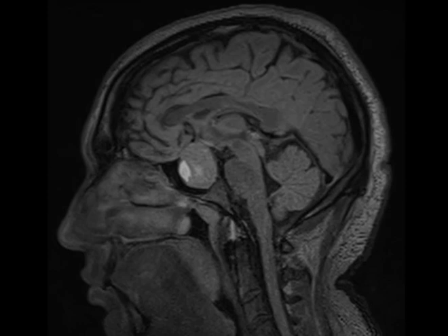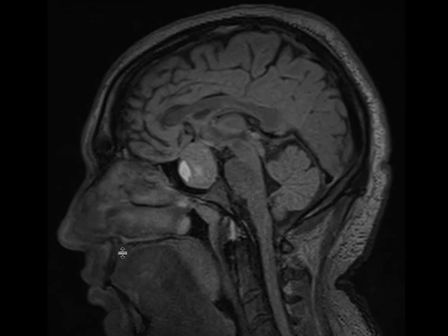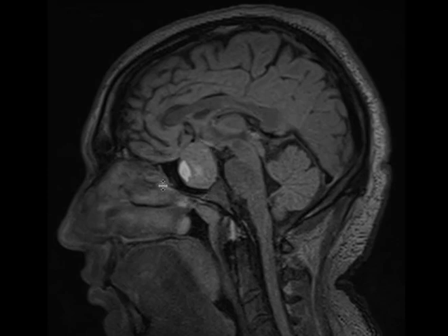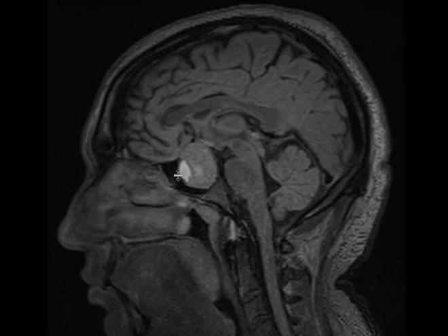This is a 42-year-old gentleman who presents with decreased vision — loss of peripheral vision specifically — and headaches. On his MRI scan, there is a large pituitary tumor seen here.